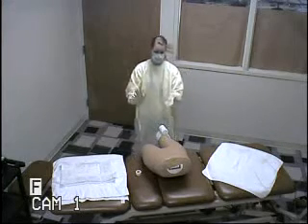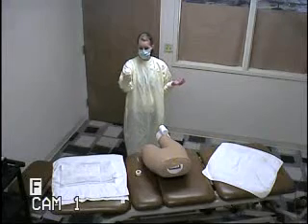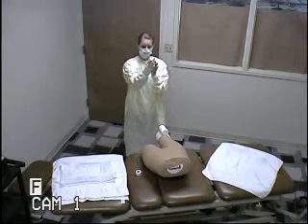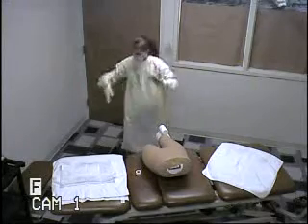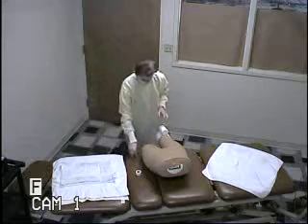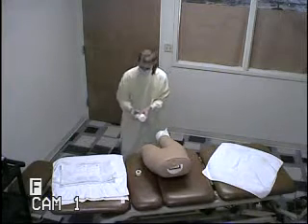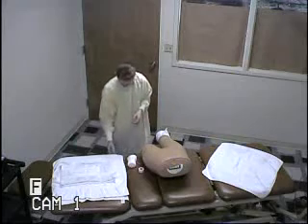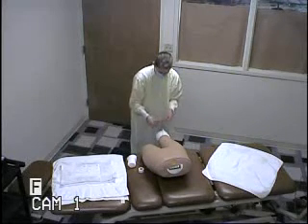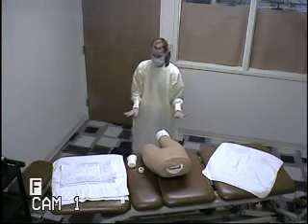We're going to balance that on there. And I take the palm and pull it off. And then on this one I have to get underneath the glove. Pull it out. Dispose of my gloves. Take my scissors. Tape my curl-ex. I already have my tape. Tape it. So that's done.